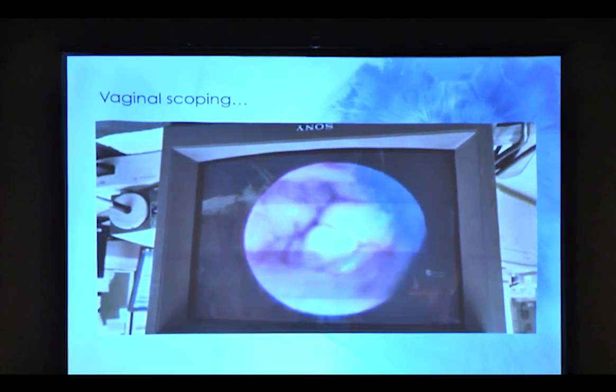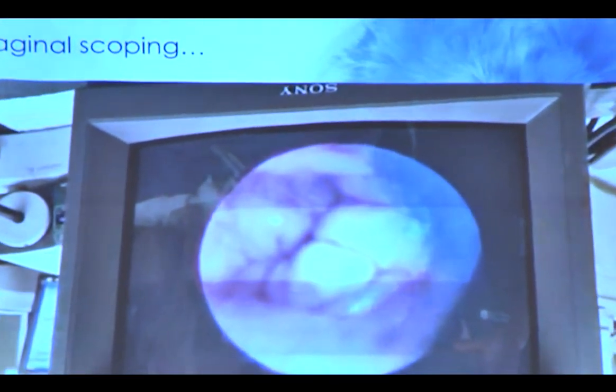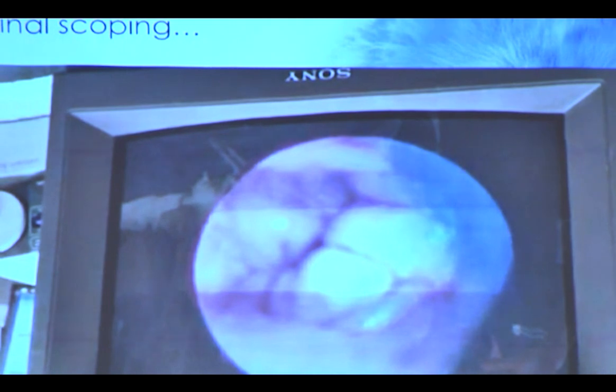And what you do is you take a tube. We have a tube that we pass down our scope, and you go right through that into the uterus. So you are actually in the uterus. It's absolutely amazing, and it works so well. The bitch is standing. Sometimes you have to give them a little bit of tranquilizer, but most of the time they just stand there. They don't care. It's amazing. Okay, you can finish that.